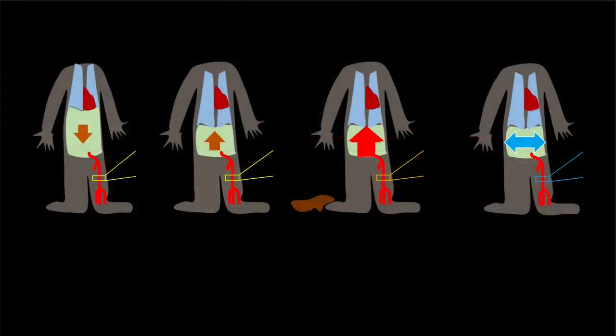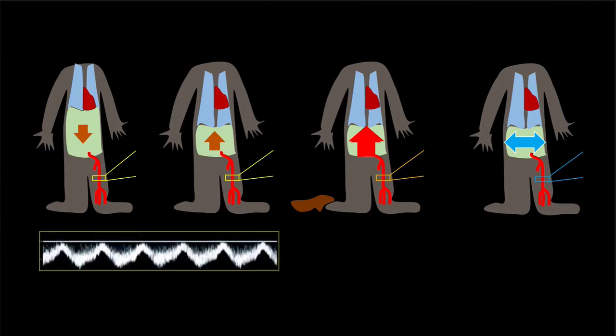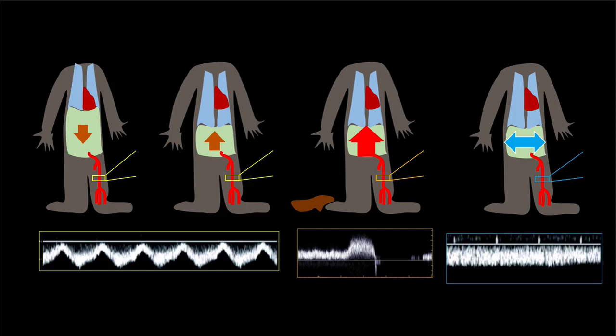All right, so summary here, quick review. You've got respiratory motion occurring with increased and decreased intra-abdominal pressure with respiration, and then you've got a Valsalva maneuver which will actually reverse the flow in the vein, and you should have a normal cessation of flow because of the valve. And then apnea, which is something I didn't talk about yet, you should just have a monophasic waveform. If they tell you the patient has apnea, that would be normal in this situation for there to be a monophasic waveform. And I'll show you a case later on when it's not normal.